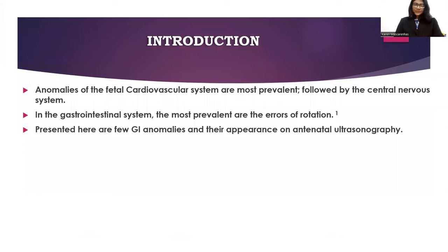Introduction: anomalies of the fetal cardiovascular system are most prevalent, followed by the central nervous system. In the gastrointestinal system, the most prevalent are the errors of rotation. Presented here are a few GI anomalies and their appearance on antenatal ultrasonography.